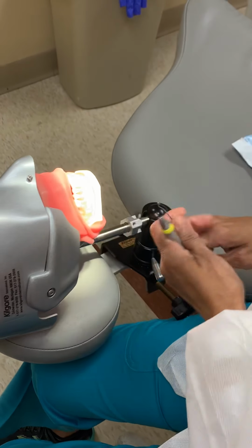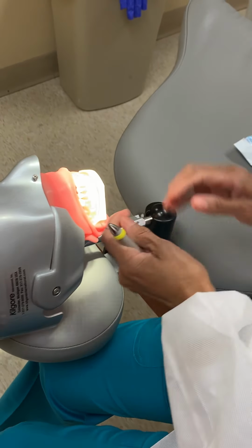Okay, now that's for the posterior. Terminal shank is always parallel on the posterior teeth. Now when I go to the anterior teeth, as Ms. Williams mentioned to you yesterday, for the anterior teeth, you're going to make sure your terminal shank here and the working end of your instrument is always pointing towards the tooth.